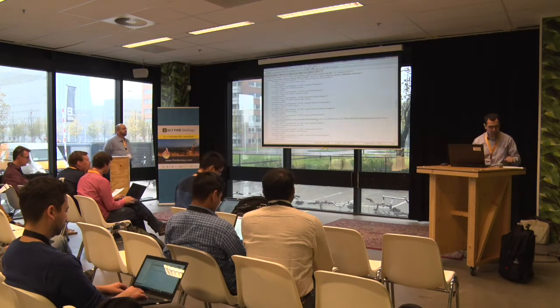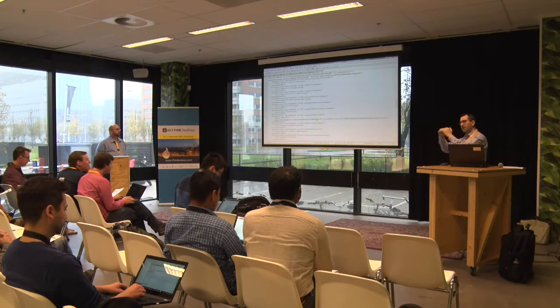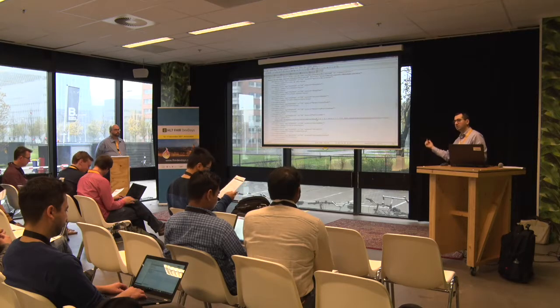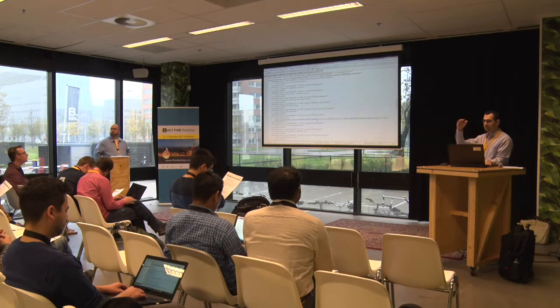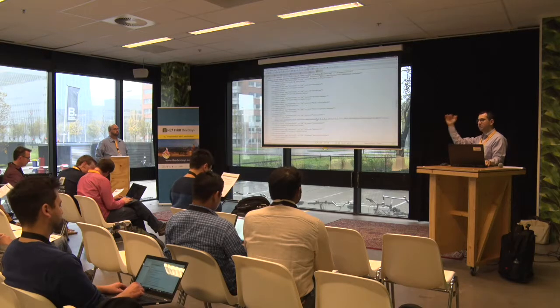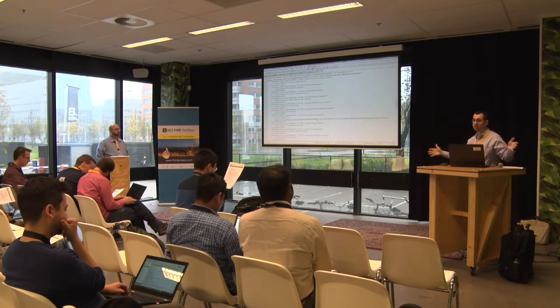Okay? Now, this is actually just giving you information about the study. If you go through the hierarchy, then you go down, and if you request more information about the study, that will lead you to information about the series within the study. And then you can get to the actual images within the study, and that's when you get to image data. So that's the whole point. So exercise 1, you start at the very top of the hierarchy, patient. Second, you go to study. Third, you go to images. And then 4th, I show you how you could retrieve a whole study if you wanted to.